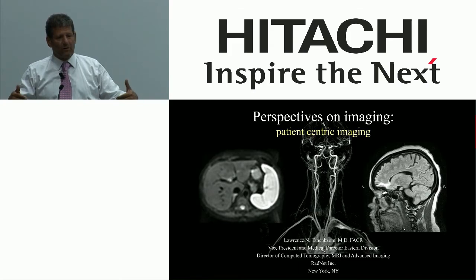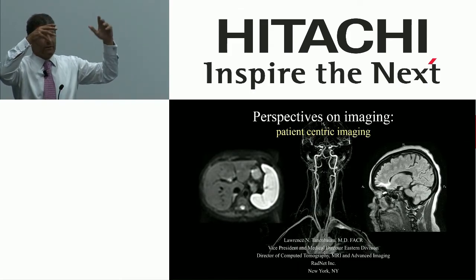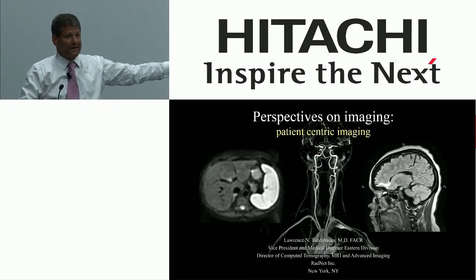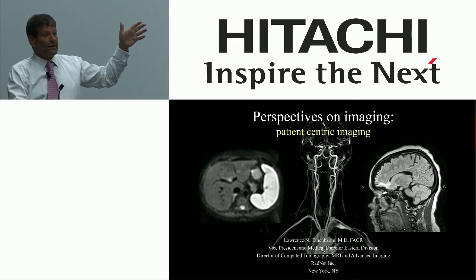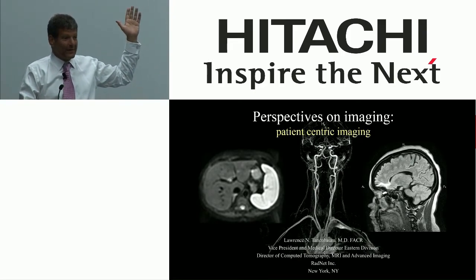These are not written in stone, but my whole point with the artists, everybody thinks that they're artists, the data says otherwise. The data says the 5-minute brain is not going to miss anything. The data says the 5-minute knee is not going to miss anything. The data says the 5-minute shoulder is not going to miss anything, okay? So if I give you 15 minutes, we're dancing in the streets, okay? It really shouldn't be that hard.